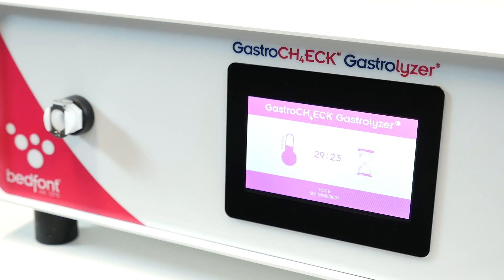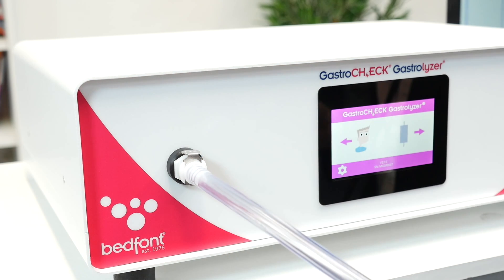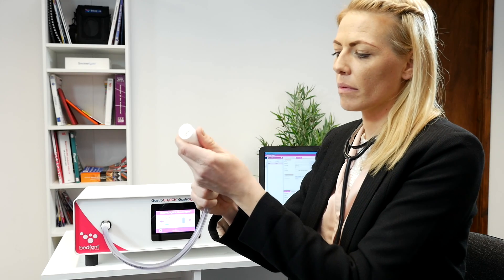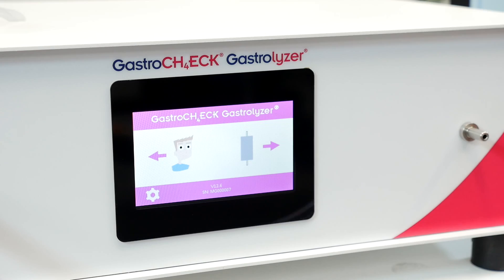Make sure the power cord is connected and the Gastro Check is switched on. The monitor will need about 30 minutes to warm up. Connect the sample line to the direct sample line connector — a click should be audible — and attach the mouthpiece to the sample line.